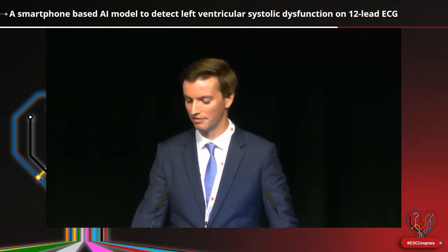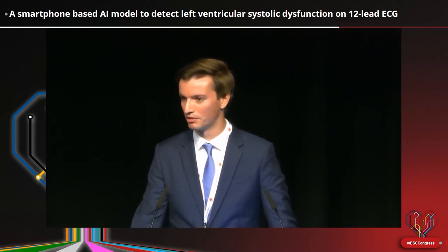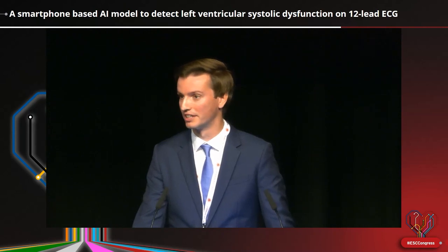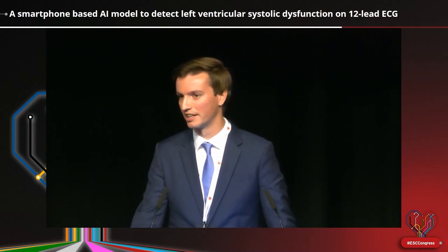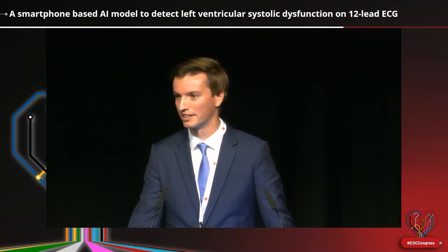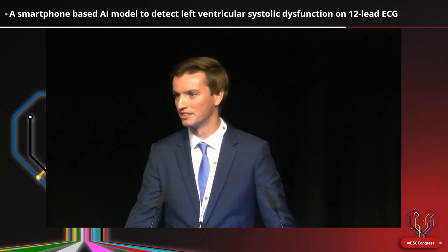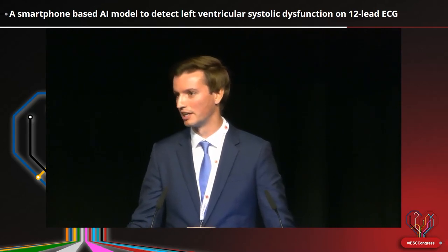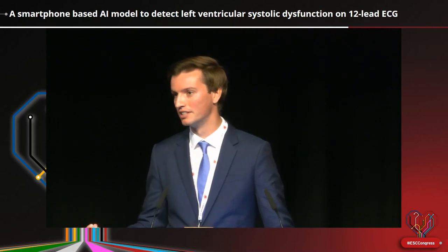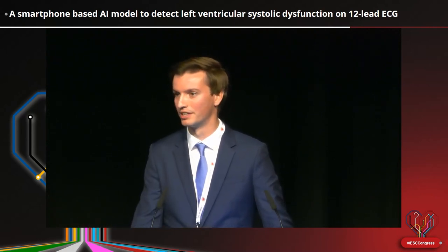For example, as a cardio-oncologist, you know that a lot of patients get an echo for screening for cardiotoxicity when they have cancer medication. And if you do 100 echoes for screening for cardiotoxicity, you know that most of these echoes will come back as a normal ejection fraction. Maybe this tool could be used as a screening for these patients, picking up on those patients who would need an echocardiography, but also reducing the needs of some other patients who have normal ejection fraction and would maybe not require an echocardiography.